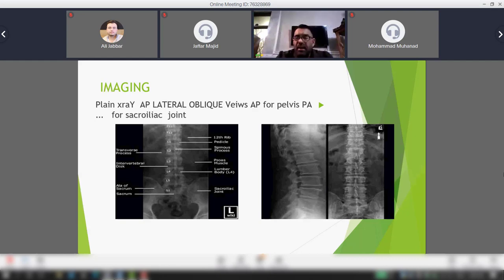First of all, we have to identify this is an X-ray, and this is an X-ray of the back. Singular, plain X-ray of the lumbosacral spine, or singular, thoracolumbar, if it is long and shows part of the dorsal spine. Plain X-ray of the thoracolumbar spine shows the sacroiliac joints, that part of the pelvis, which is labeled or not labeled.